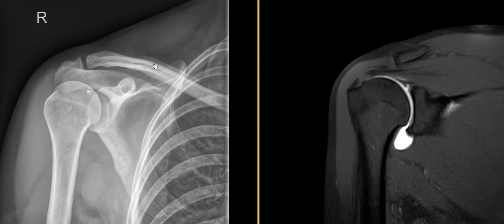We have a procedure — on the left here we have an image from that procedure that we perform before they go into the MRI room. So the patient will come in, we will clean their shoulder and take an X-ray to find positioning, and we will put a needle in. Here's the needle — we're looking down the barrel — and this is projecting over the medial superior part of the shoulder right in this region here.